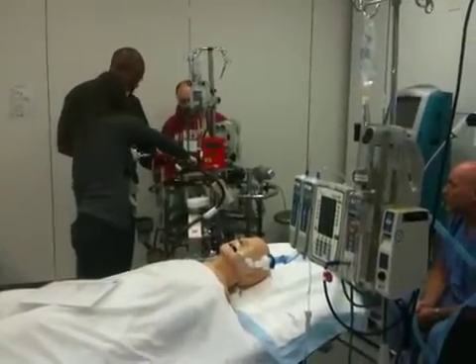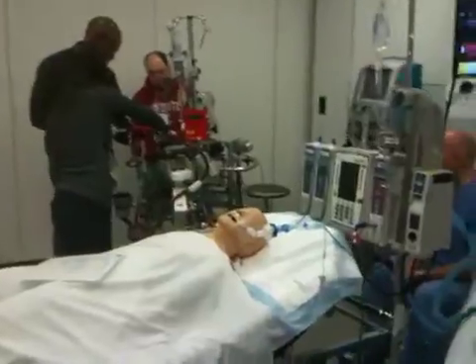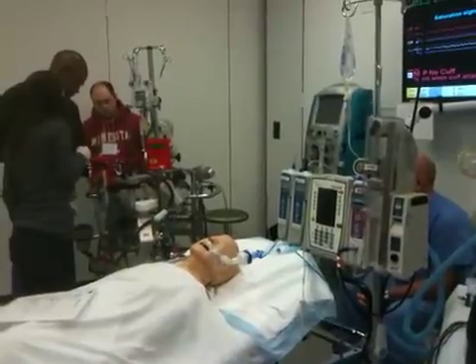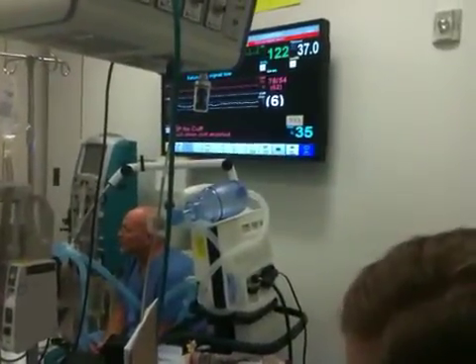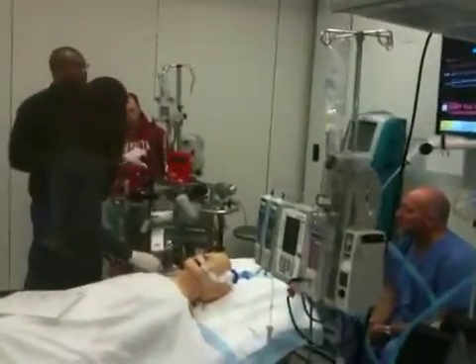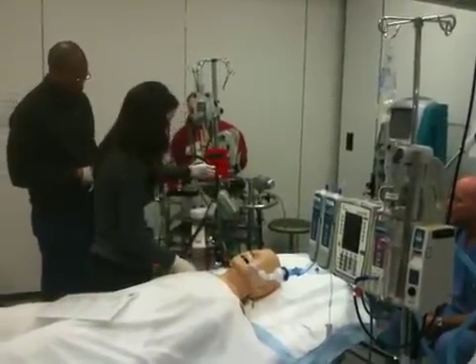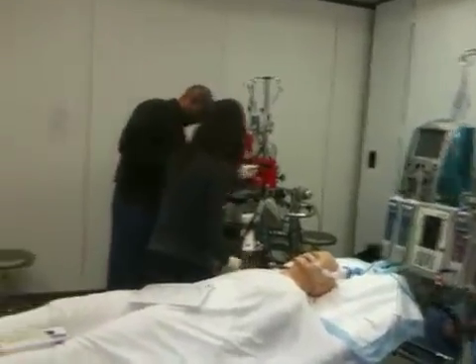It's looking at our pins, they're all the way to 0. Should start like this. Still says fault level. Yeah. Push that. And then we're gonna look. There we go. Some forward flow should be there. Alright. So we have to take the clamps off, the patient is back on ECMO. All right, let's stop. 5 minutes.